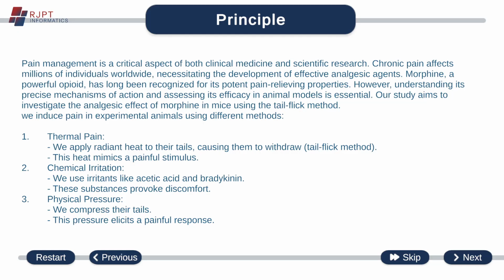Then physical pressure. In physical pressure, we compress their tails, and this pressure elicits a painful response. Compressing means we press their tails so that pain is induced in the tail, and this is how a painful response is observed in the animal.